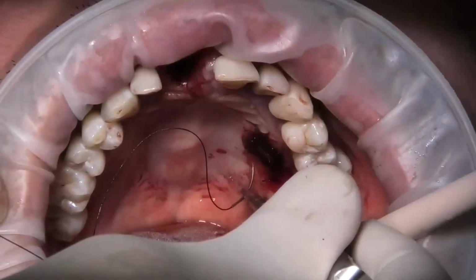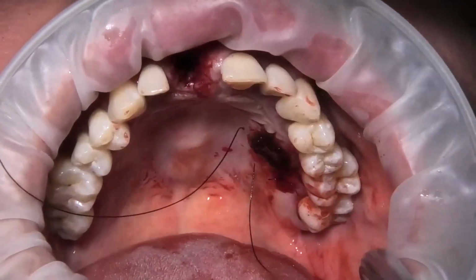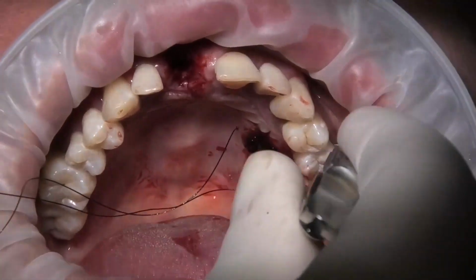So when we finish this area, we go to work with the palatal punch.